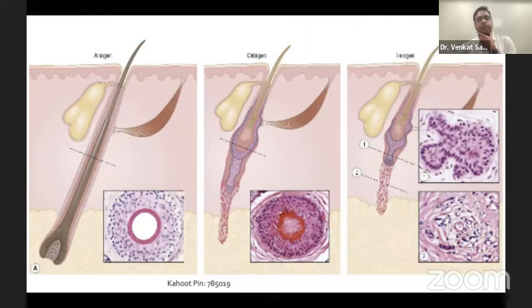All right. So how do these telogen and catagen hairs look on histology? Anagen hairs we've already discussed. Catagen hairs basically have a very eosinophilic, crumpled inner root sheath. That's how we recognize catagen hairs. Telogen hairs are the further stage down. When you take a cross-section of the upper part, you see a star-shaped remnant of the hair follicle. That's how we recognize telogen hairs. If you look lower down, you see what is called a follicular streamer, which is a collection of blood vessels, fibrotic tissue, and some inflammatory cells, okay? So that's how we recognize the different phases of the hair cycle.